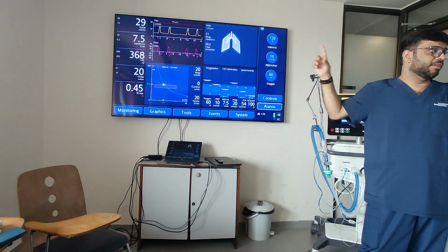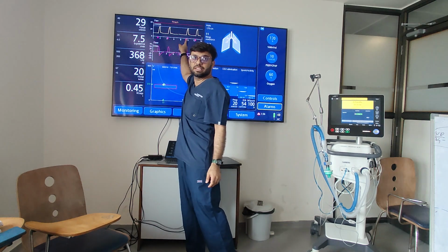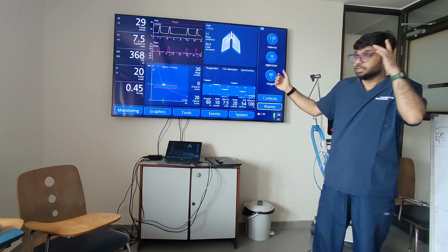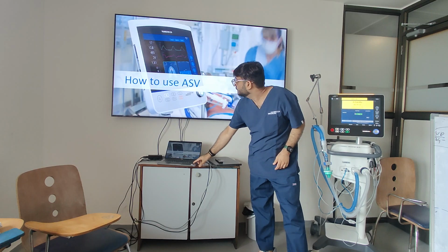This high resolution picture is from a real patient. I have taken it from the pen drive and attached it to show. So you see the patient is breathing at a normal rate. His spontaneous breathing is still there, and he's generating a fair amount of volume. So I think you can accept this setting, right? And similarly, we will do the same thing in the background.